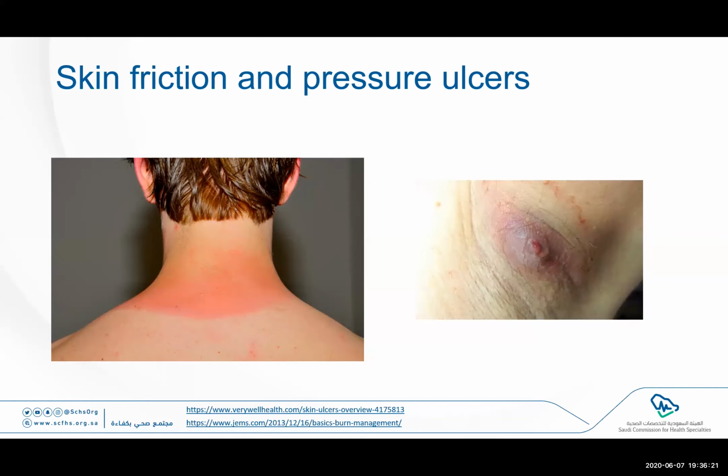And we recommend that to be part of the routine nursing care. In terms of the pressure ulcers under the arms, applying Duoderm or some barrier dressings between the straps and the patient's skin might be helpful. Applying a towel, where you roll it under the patient's armpit and then place the strap, might help.